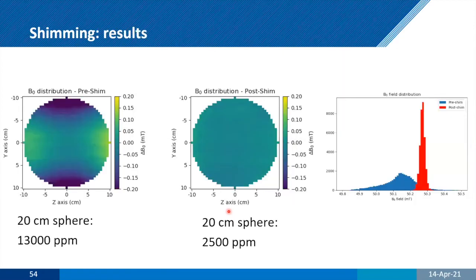And the results of the shimming then show a significant improvement in terms of the ppm. And again, you can see here, this is the field distribution. So your field gets a little bit higher, which is great because you're adding more magnets there, and the distribution becomes a lot narrower. So now you really have a system which is usable, right? Which we can think about with a reasonable gradient strength, we can actually get quite high resolution images.